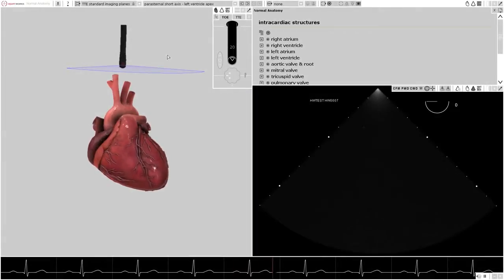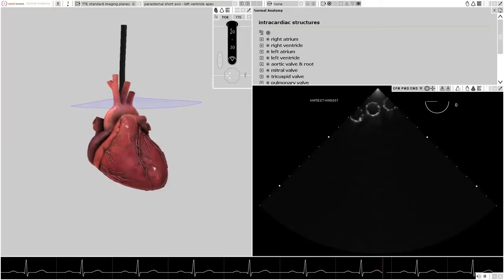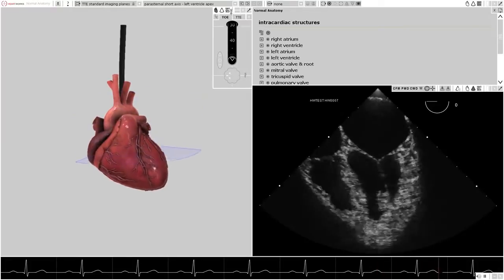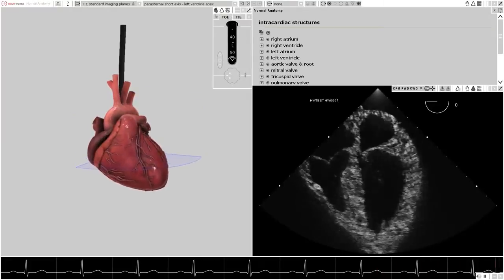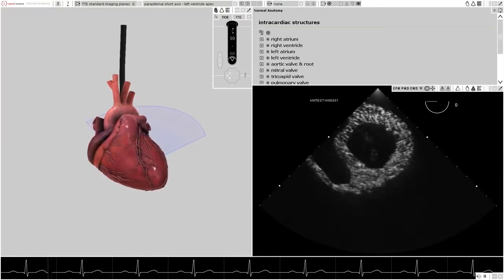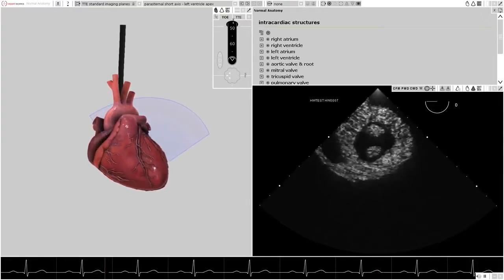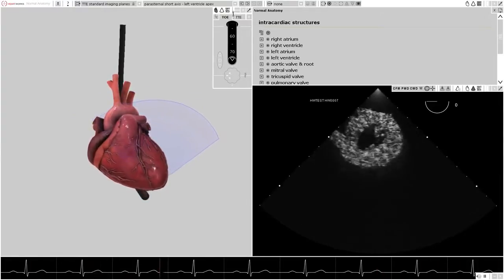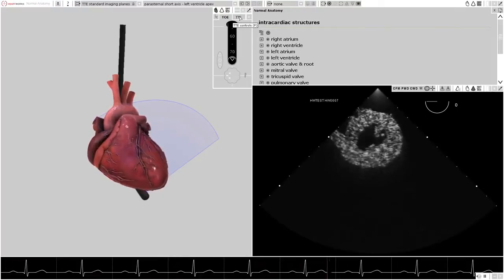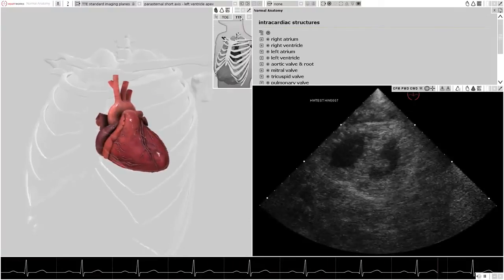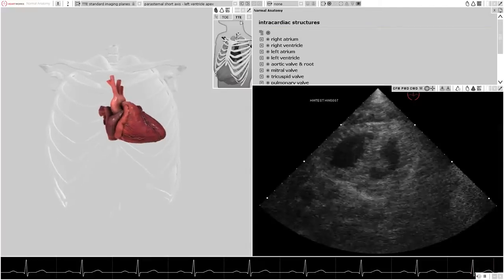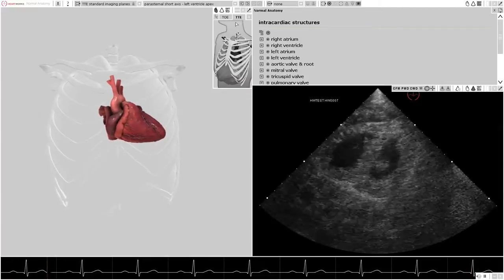It is possible to switch between imaging modalities whilst the program is running. To activate the TTE probe, move the mouse cursor to the TTE tab within the probe control panel and left click the TTE tab.